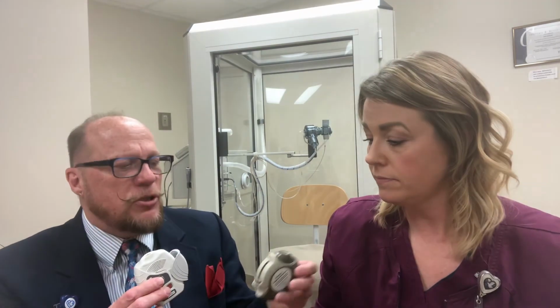Some of them have counters on them as well, so that you can see this one has a number counter, and it will tell you that you just took it, so it'll go from 14 to 13. It usually tells you how many you have left in the container. And the same as on this one, it has a little counter window here. Some of them have a little counter that's on the top. This one's fake, it doesn't move, but it has a counter on the top. And those are good too.